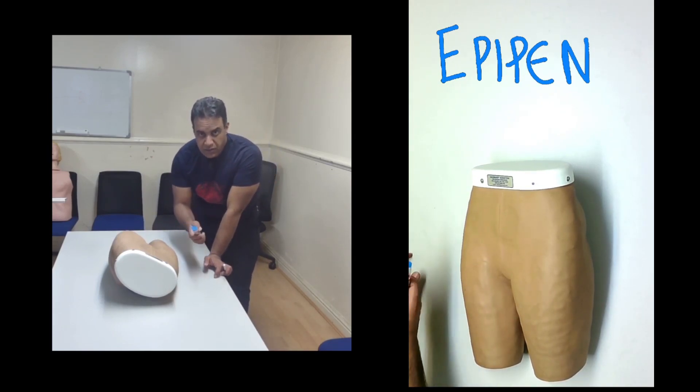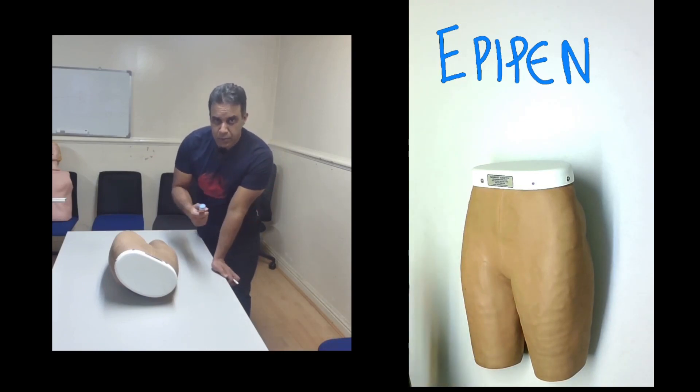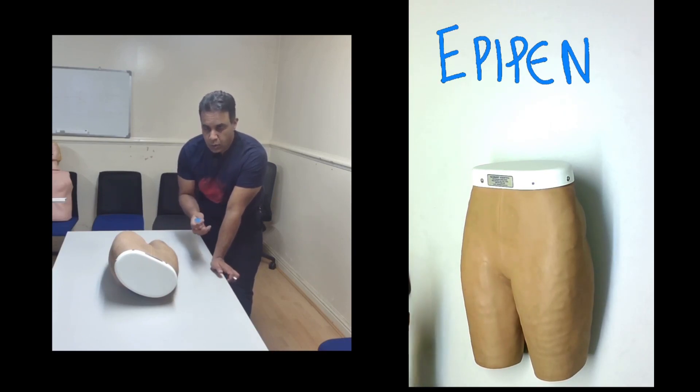Before we deliver the EpiPen, we need to make sure that the patient knows what signs and symptoms to look for — things like difficulty in breathing, swelling, itching, rashes, and nausea or vomiting. These are the important signs and symptoms. We need to explain this to the patient so they know what to look for.